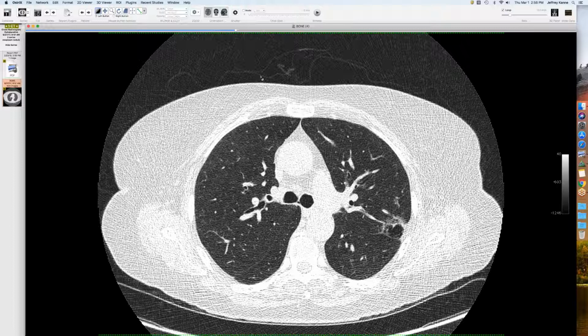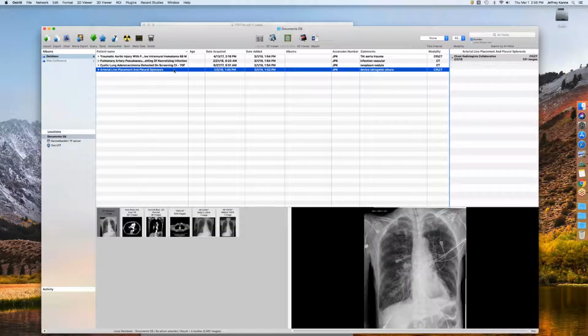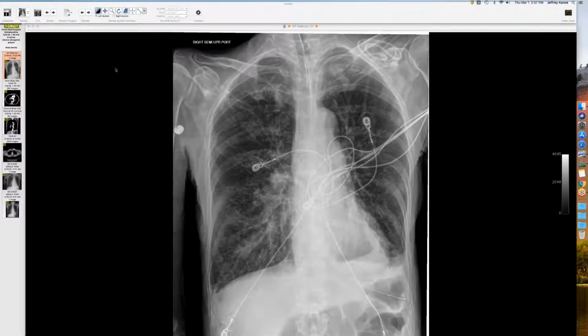But it's what we all know that's hard to put into a classification system. But I think one that may get more attention as we get more data from registries and stuff. But every 4X, we've had about 3 of them, and every one was a cancer. Not surprising. Okay, this last case it's a twofer, and it's just a great teaching case.